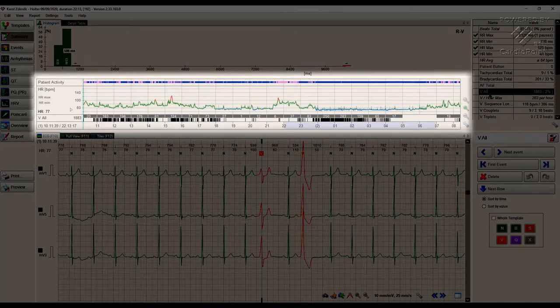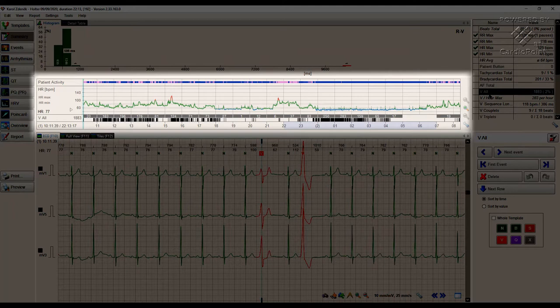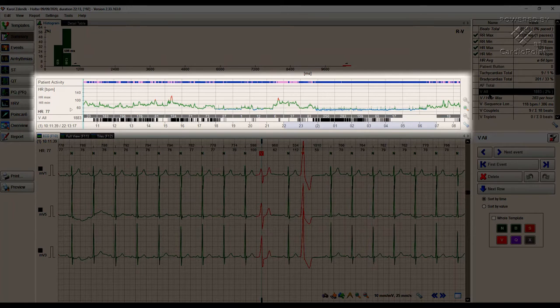We can also find the Trend Component on the screen. You will find the Trend Component several times within the program and every time the user interface is always the same. This provides a comfortable workflow with BTL Cardio Point Holter.